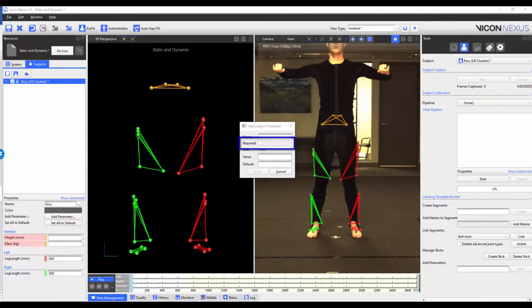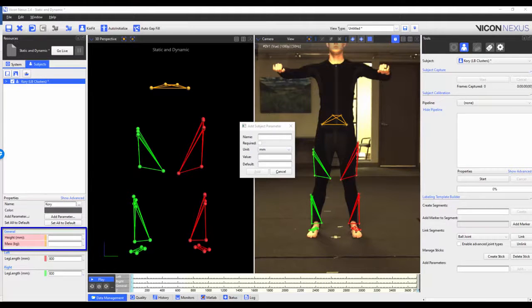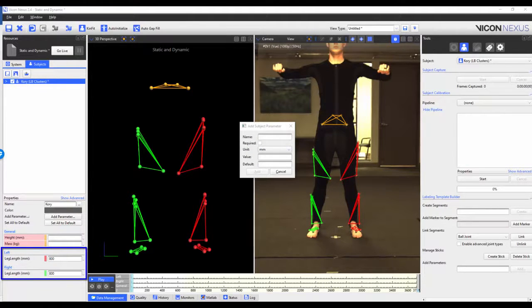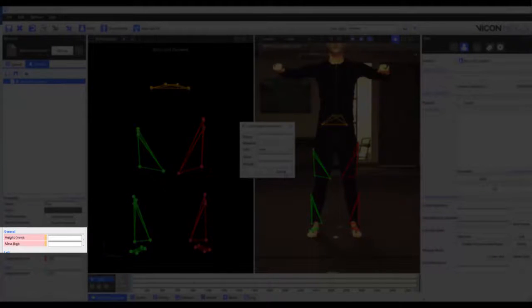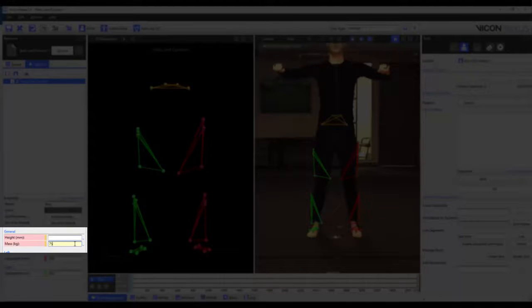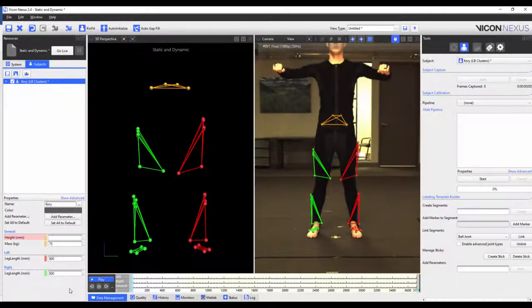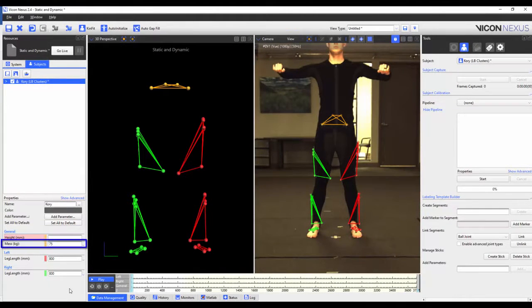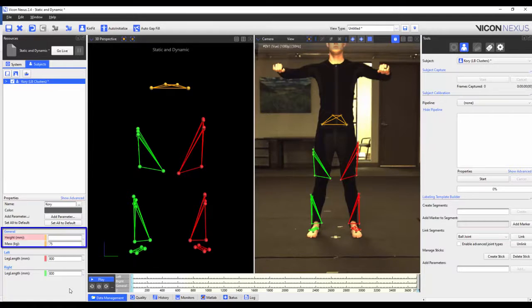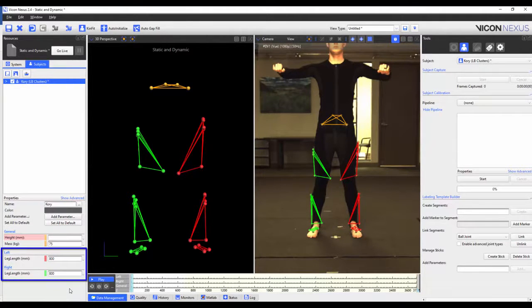If you have the required box checked, the parameter will be in pink in the properties. In this example, the height and the mass are required properties, but the left and right leg lengths aren't. When a value is written in, the color reverts to the background color. You can also see that the units are appended to the parameter name, with height being set to millimeters and mass being set to kilograms. The value is a pre-existing value that appears in the subject parameters. In this example, there was no value set for the height or mass, but the left and right leg lengths were preset to 800 millimeters. This value can be overwritten.